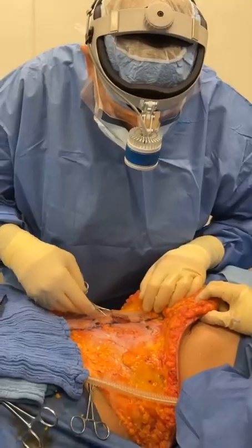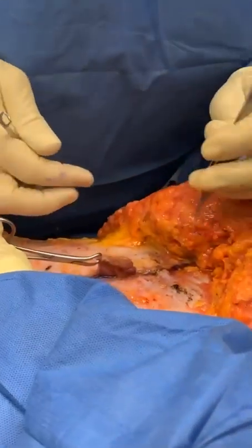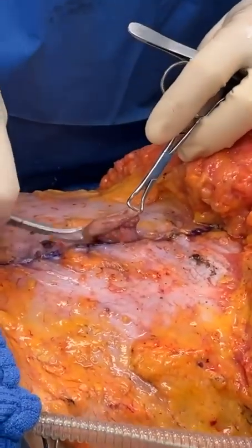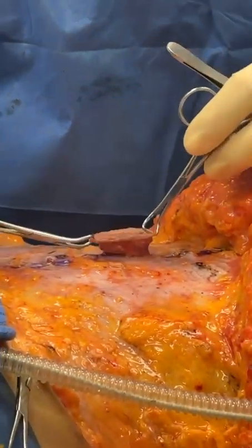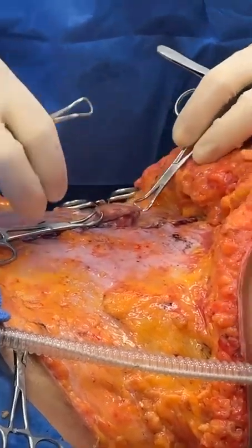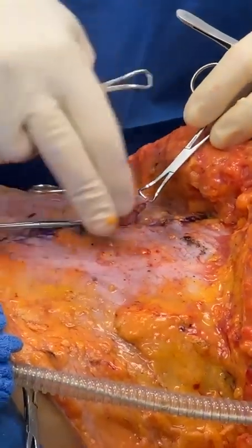Thank you. Okay, so what we're doing now is we're going to go ahead and trim the belly button, but I want you to actually, we'll let go of this and let her see. So that's your belly button, but lower yourself down. You can see how flat and nice she is with the rectus plication above and below the belly button. Now we're going to trim the edge of the belly button and pull it out through no skin. But she's nice, flat, and tight right here.